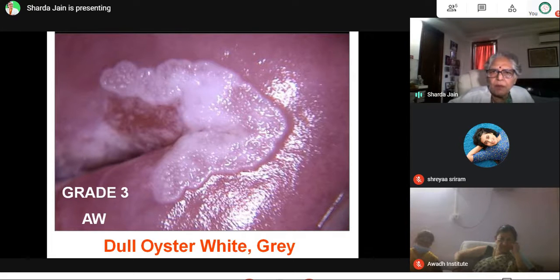You can see the margins are very well defined, clear, and it is a raised surface. It shows a higher grade lesion.